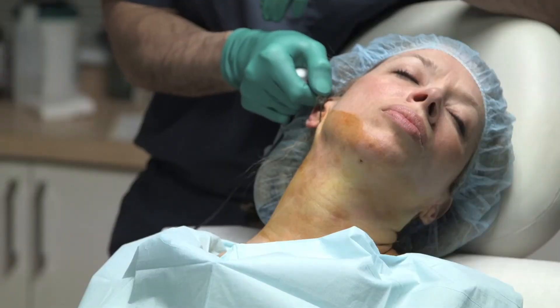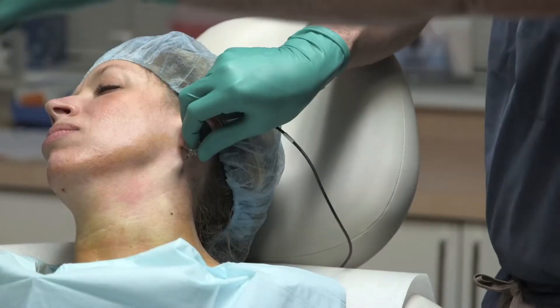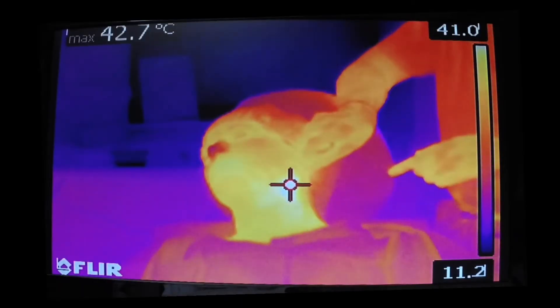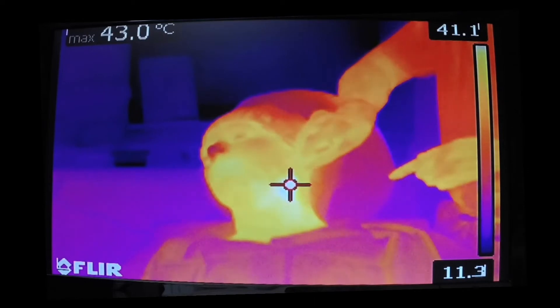For each of the passes, the probe is advanced at the farthest point into the neck and slowly retracted at about a three to five second interval.